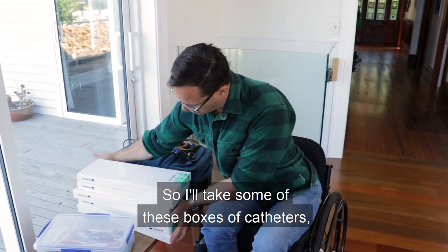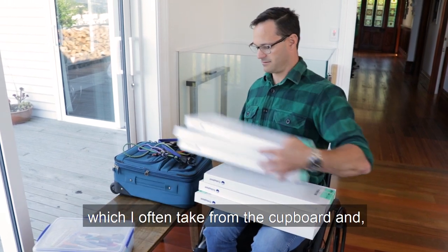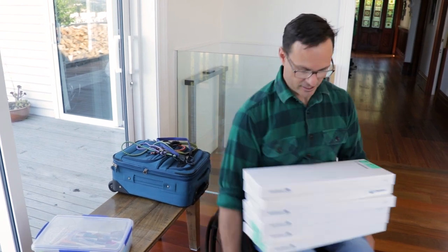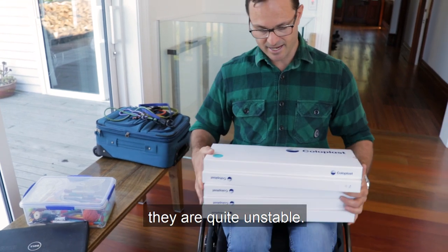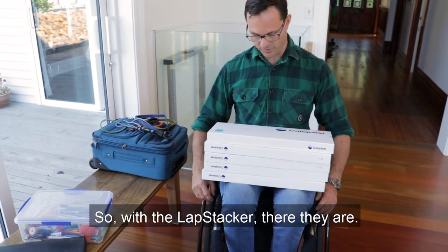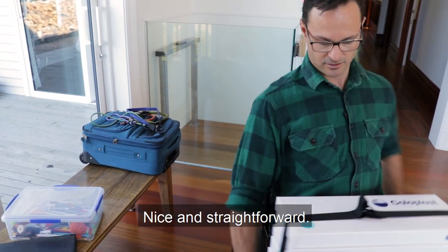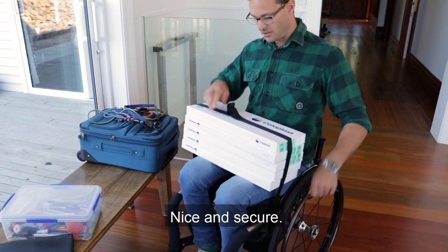So I'll take some of these boxes of catheters which I often take from the cupboard. And as you'll see, they are quite unstable. So with the lap stacker — there they are. Nice and straightforward. Nice and secure.